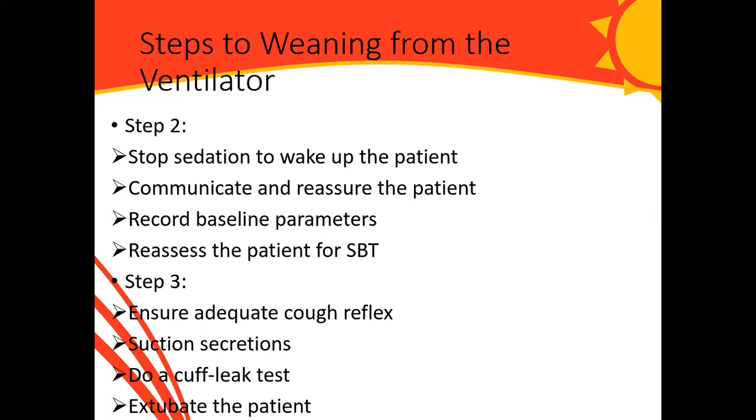You stop sedation and you communicate with the patient. This is critically important. Like I keep telling everybody, you talk with the patient, you communicate and reassure the patient. You explain what you are going to do for the patient. And the patient, now awake, should follow your command. Then you record baseline parameters, the patient's heart rate, SpO2, blood pressure, and all that. Then you reassess the patient again for the spontaneous breathing trial and ensure that the patient has passed it.